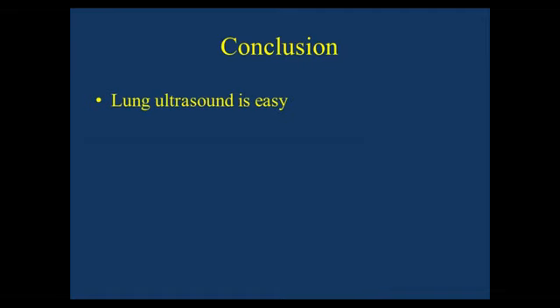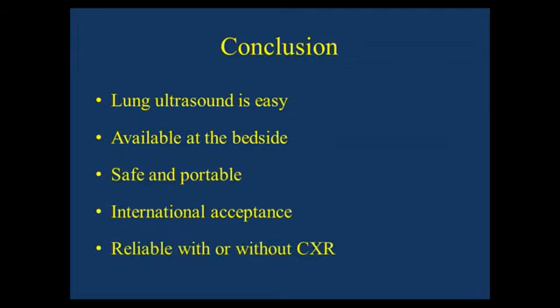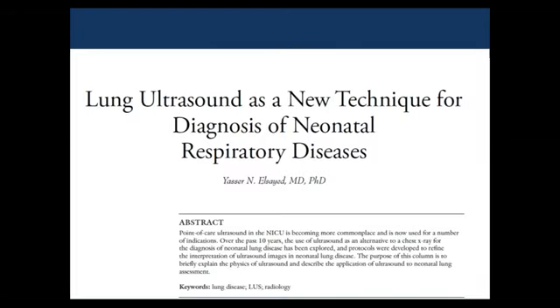Then the conclusion: lung ultrasound is easy, available at the bedside, safe and portable, with international acceptance, and some units all over the world have started to rely more on ultrasound for assessment, with less X-ray exposure. It is reliable with or without X-ray, so you can do it as a parallel modality to the X-ray or without X-ray.